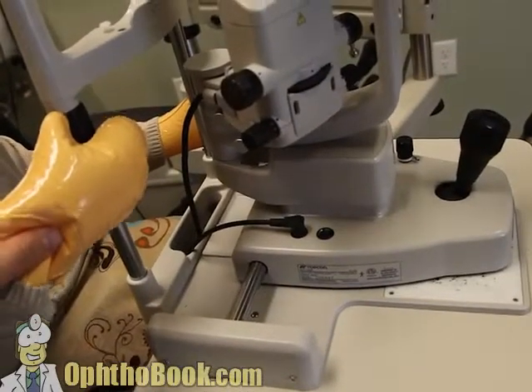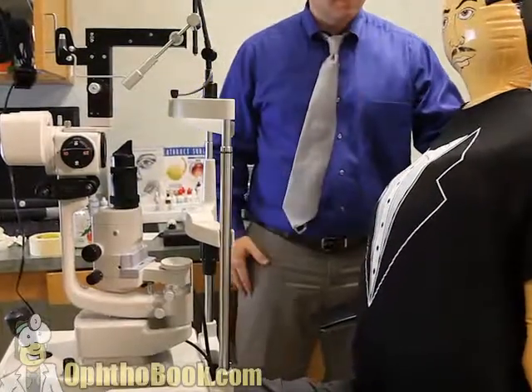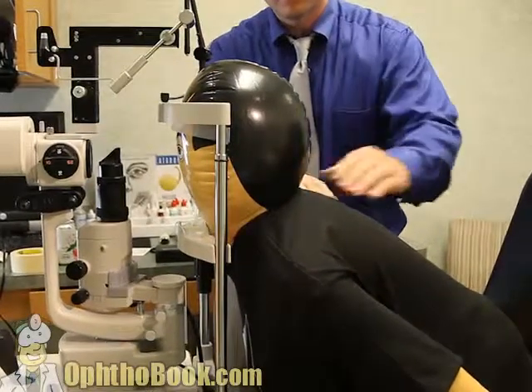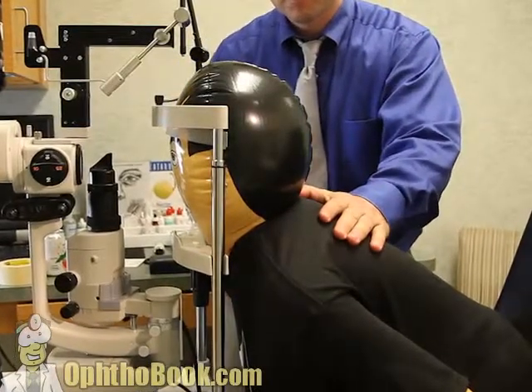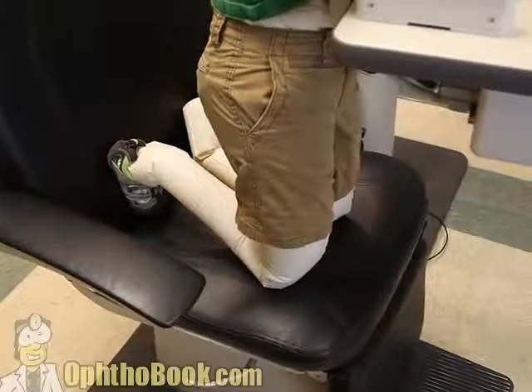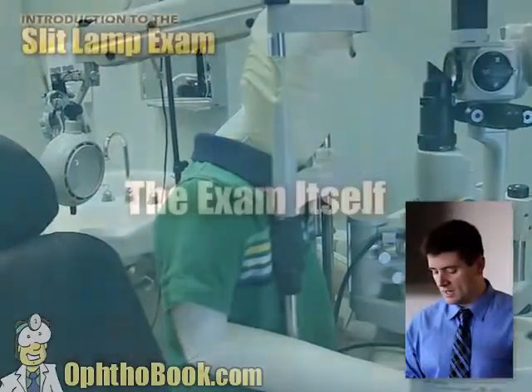The patient can grab onto the side of the table or microscope. For a patient with a large abdomen who has trouble reaching the microscope, make it very low and far away so they can rotate down and into it. Push on the middle of the back — not the head — for better chin position and safety. Occasionally a patient does better standing up. With children, who have short torsos, have them get on their knees to reach the microscope.